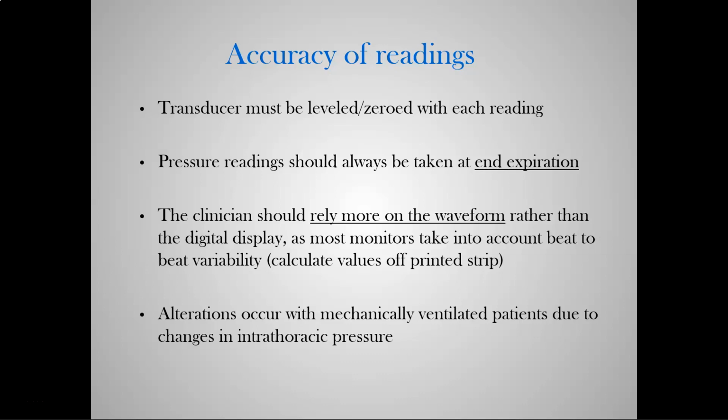Okay, but the physician's going to say, hey, here's what I have. When I do my wedges, I get a pressure of 1. I get a pressure of 2. Okay, and the physician's going to be like, okay, well, what's the waveform look like? And you're saying, well, it's dampened, it's restricted. And then from there there may be a need for a chest x-ray and further advancement to make sure it's in the right place, or even pull back a little bit. Okay, so just be aware of that.